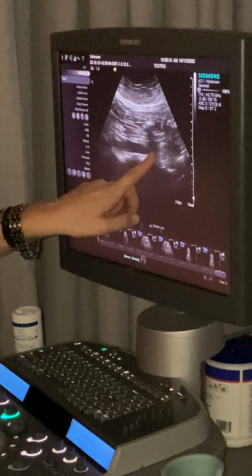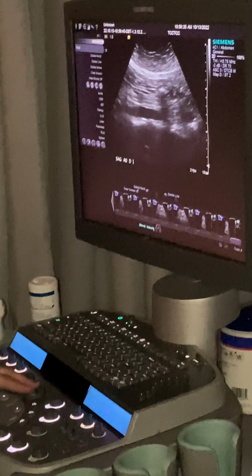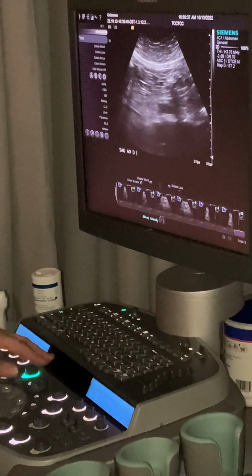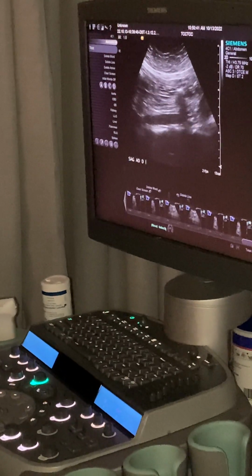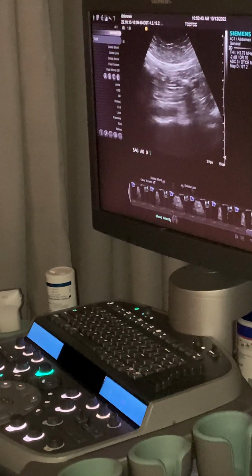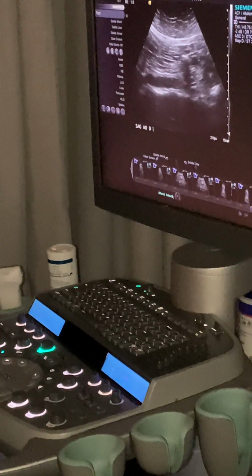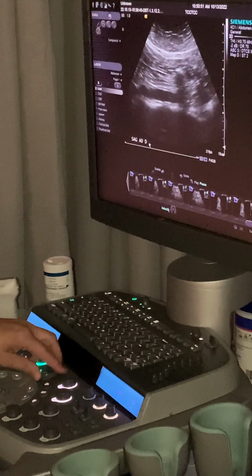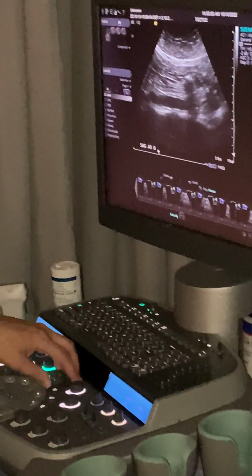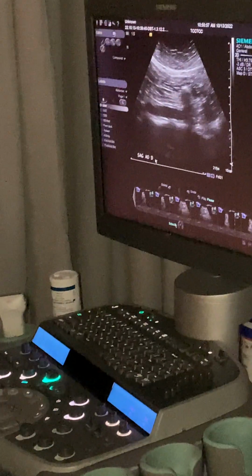Since we are tapering at the iliacs here, we're gonna take a look at them separately. All we need to worry about is our distal. Distal likes to be coming a little bit more uphill, whereas our iliacs like to go downhill. So our iliacs may fill with one color and our distal may fill with another. Totally okay. Let's get horizontal. We've got nice clean wall to measure. I'm gonna back it up to systole, to where it's the widest.